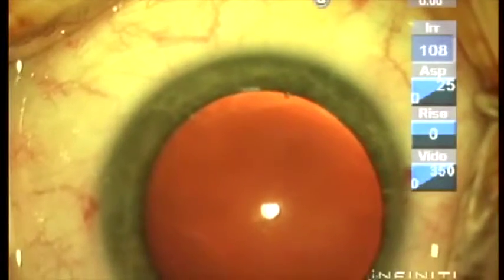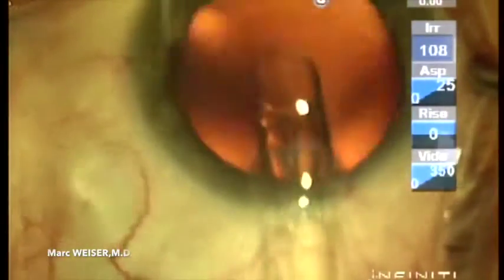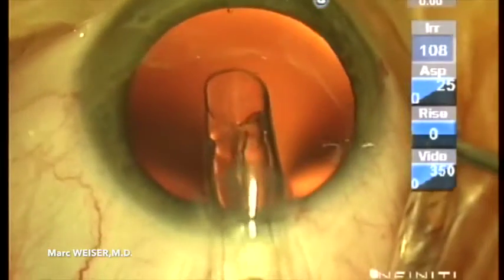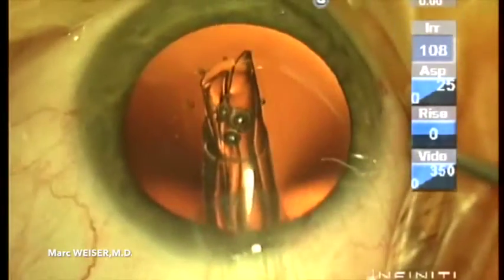The ICL will be injected through the main incision. Then, it unfolds gently and slowly into the anterior chamber.